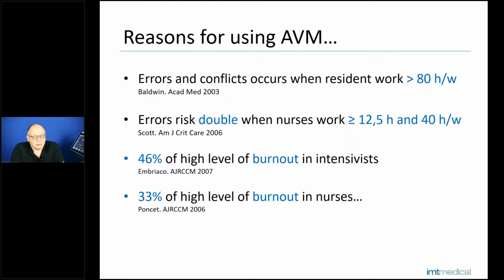And AVM is also trying to reduce the workload so that you don't have to do additional settings for ventilation. The controller, the computer, and the ventilator relieve you from settings, and that's the intention of AVM.